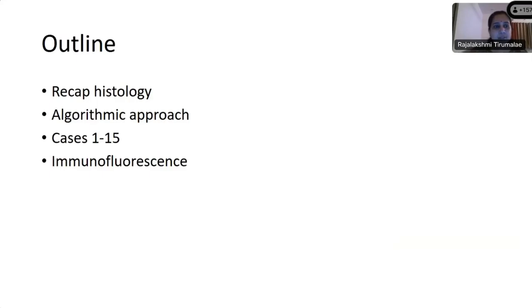A recap of histology. Although I'm sure everybody knows it, and how the pattern-based or the algorithmic approach works. And then we'll go into the cases. And when we talk about bullous lesions, I'll also be talking a little bit in detail about immunofluorescence. So I hope that is okay with everyone.